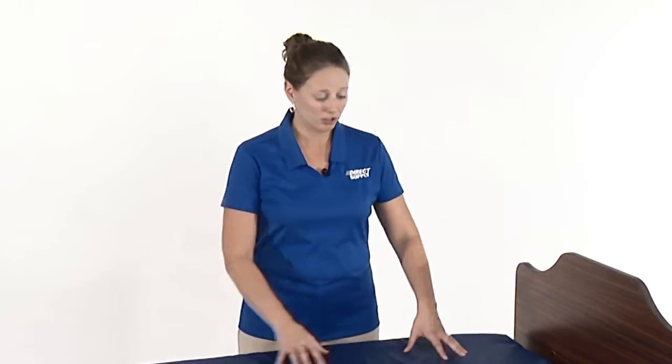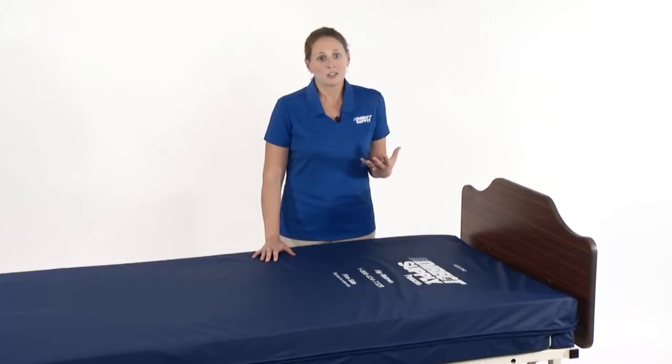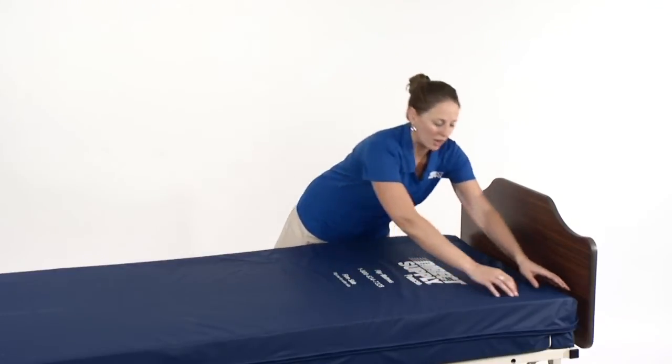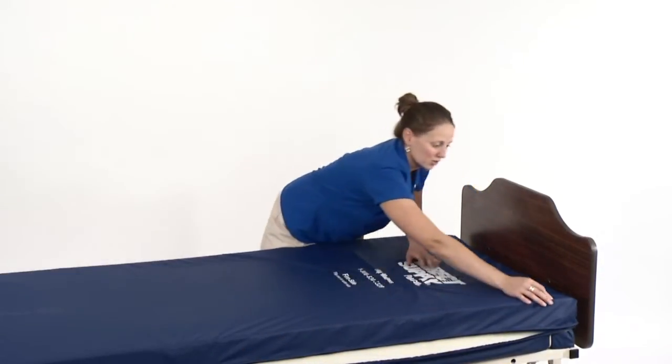For those of you familiar with our Panacea line of mattresses, you'll notice that the Panacea Flip Mattress uses the same four-way stretch cover on top and bottom, which is very good at not allowing moisture in, yet still very breathable and good for your resident's skin. I'm going to remove the cover now so that you can see the inside of the mattress for the rest of the demonstration.